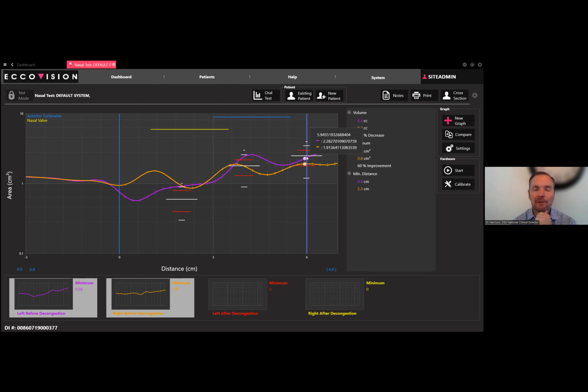I think clinically too, you can verify what you see on the graph with what you can hear in the treatment room. So I would have them place the finger over the left side, close off that nostril, have them take a breath in, then do the other side. If one was significantly smaller than the other, like when you get a stuffy nose and one side plugs up and the other you can breathe through, and then you wake up later and it's flipped, or both sides are completely closed off, you'll hear the sounds.